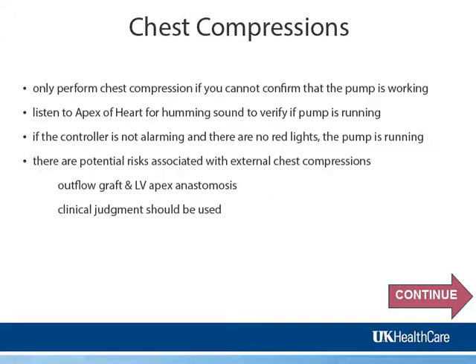Chest compressions are allowed for a clearly symptomatic patient. If the pump is not functioning or it obviously is not providing the support needed to perfuse the patient, chest compressions are then required per BLS and ACLS guidelines.